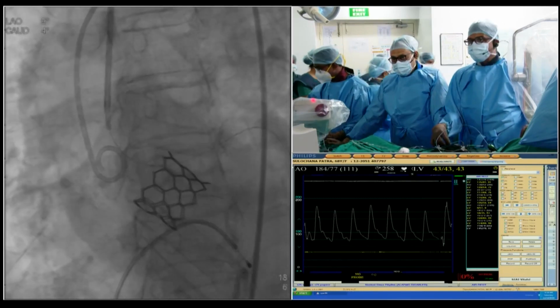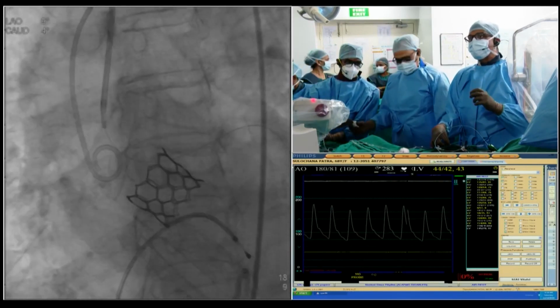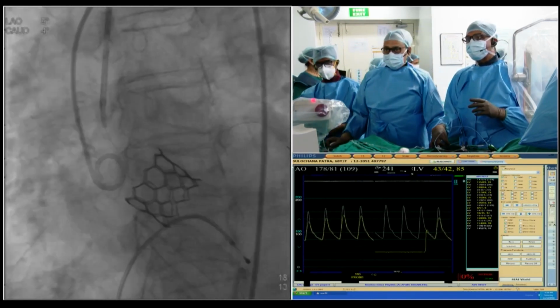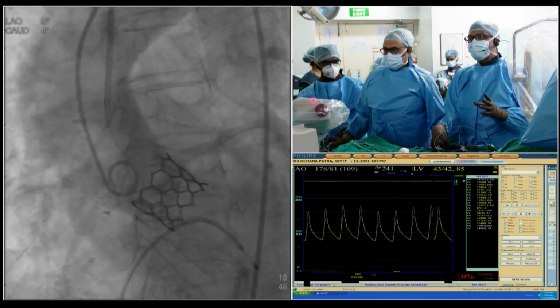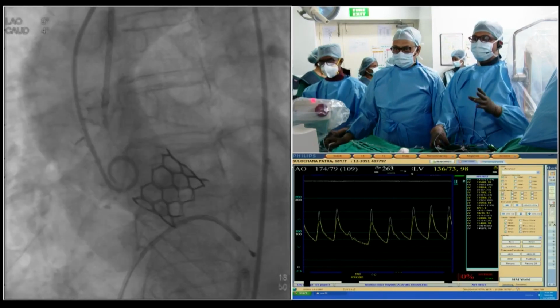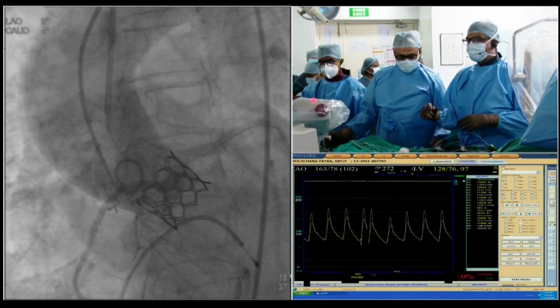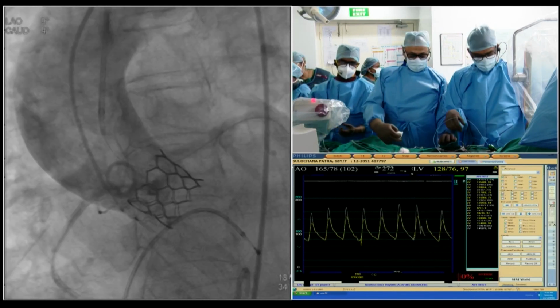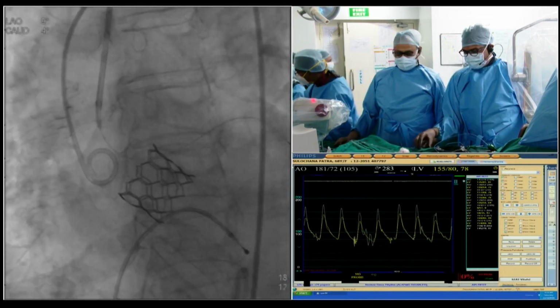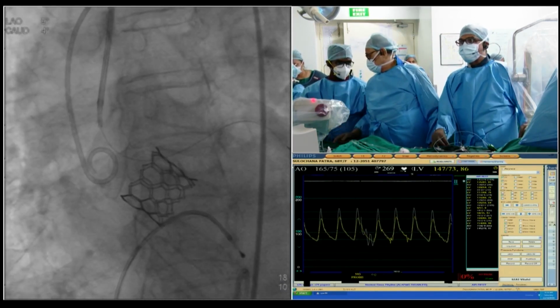So I think somebody asked earlier why balloon expandable and not self-expanding. Look at the size of the aorta. It is slightly aneurysmal in this patient, even though she has a tricuspid valve. Based on the aortic root size, I actually feel the dissections are higher in such patients when you don't have the ability to flex your catheter. In the future, the FX is making it a little bit easier, and maybe those are things we can think about, whether valve type might make a difference.